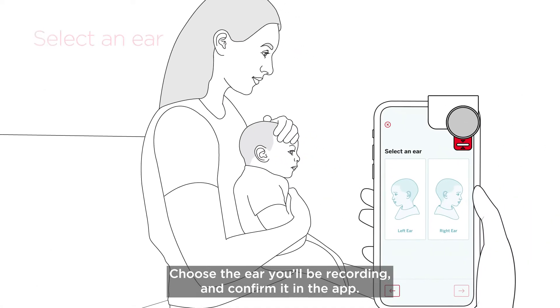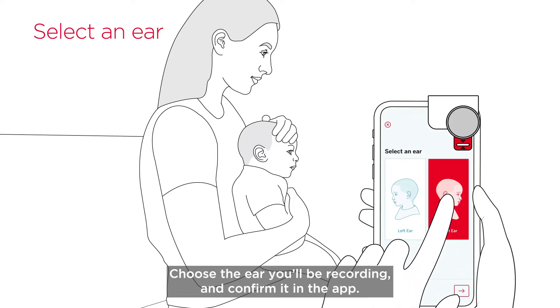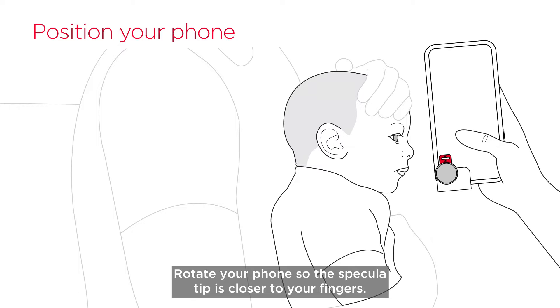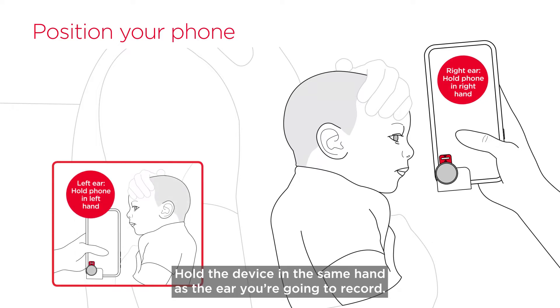Choose the ear you'll be recording and confirm it in the app. The next step is to position your phone. Rotate your phone so the specula tip is closer to your fingers. Hold the device in the same hand as the ear you're going to record.